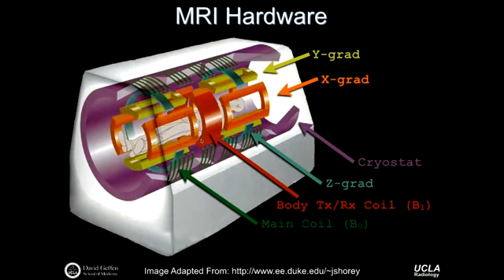It can actually be switched very quickly to be used as a receive coil. So you could transmit radio frequency energy and then turn it into so-called listening mode and receive energy coming back out of the object of interest. Because that coil is relatively distant from the object itself, it's not a very good receive coil. It does have some practical uses, but in principle it can be used as a receive coil, but it's not really done very commonly that way.